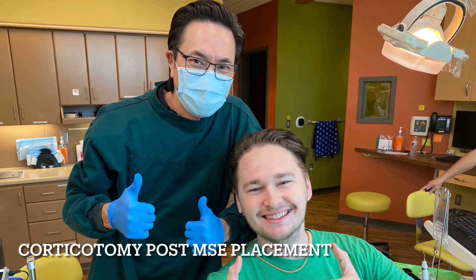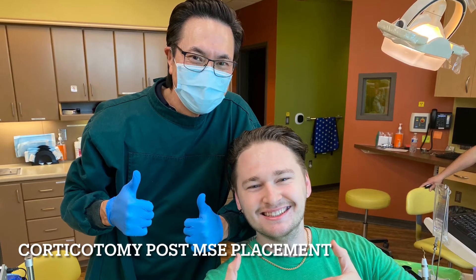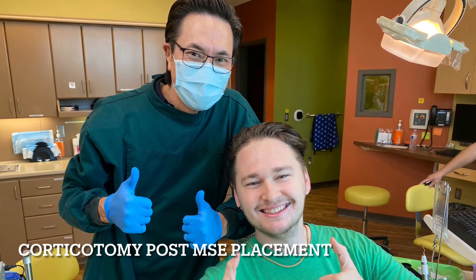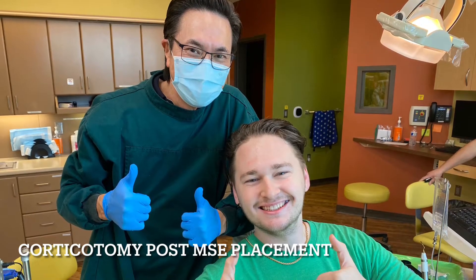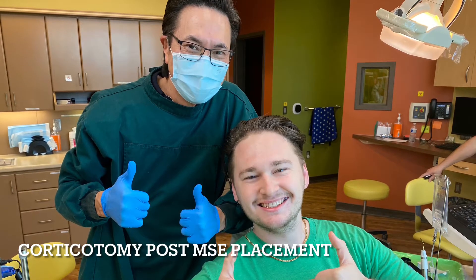This patient is 23 years old and had MSE with cortipuncture treatment with Dr. Ting. The cortipuncture treatment failed to expand his palate, so Dr. Ting performed corticotomy.